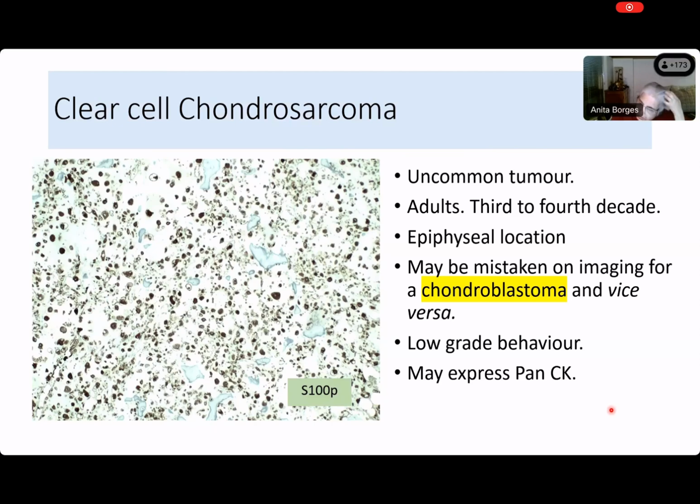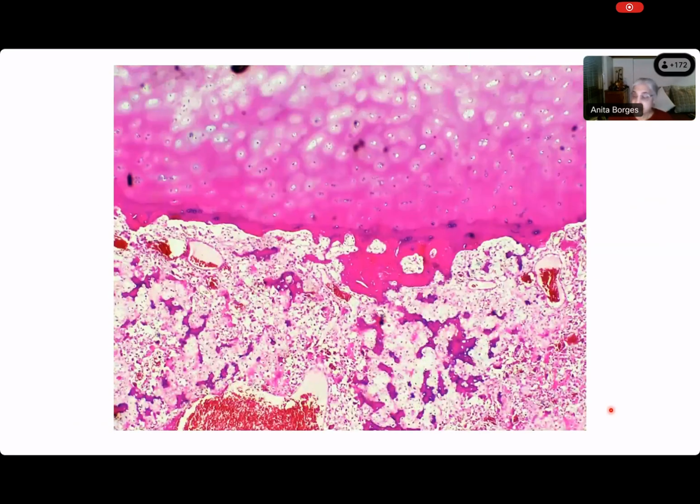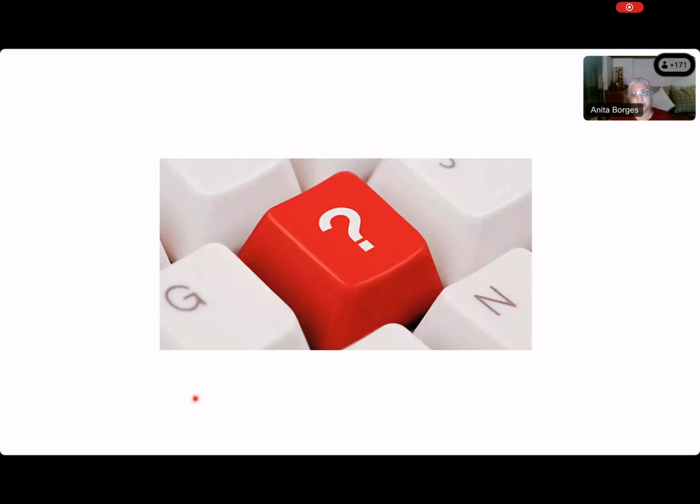Yes, somebody remember? Well-defined. Well circumscribed and or encapsulated. Why is it so in benign tumors or slow-growing tumors? We expect all benign tumors to be slow-growing, right? And that's why they have time to build a capsule or a good circumscription around them. They erode rather than infiltrate. And you saw that so beautifully in that cartilage. Did you see that cartilage? It's not infiltrated. This cartilage is beautifully intact, although now you have a tumor that is an obviously malignant tumor. You got that, Sarangi? All of you? Are there any questions that anybody wants to ask or in the chat box or whatever?